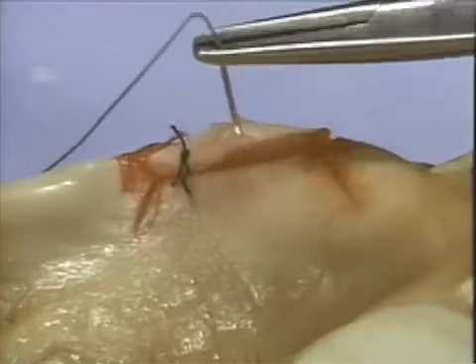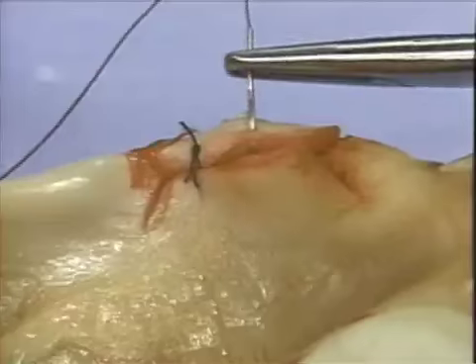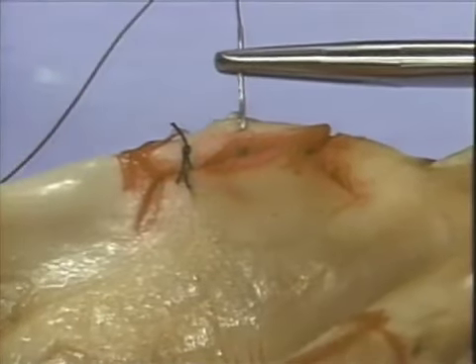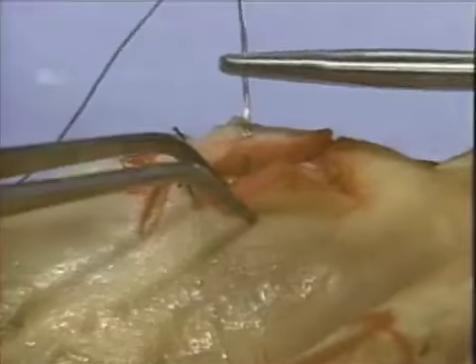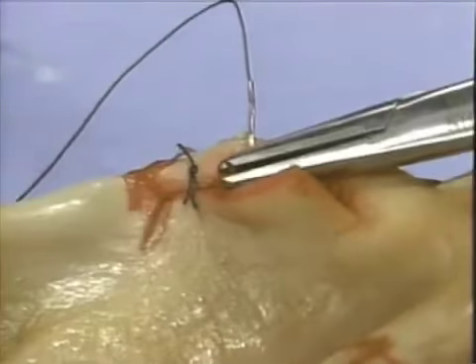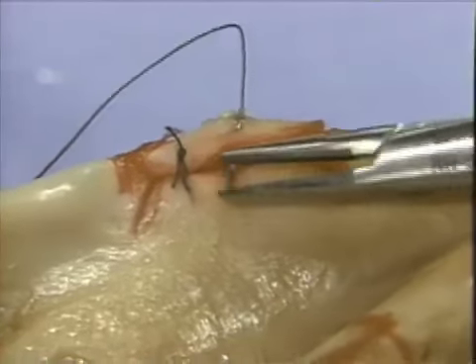We will now compare the figure-8 suture to an interrupted loop suture, which is more widely used in periodontal therapy. In this technique, the suture needle is passed from the oral side of the buccal flap to the tissue side, but then is advanced through the lingual flap from the tissue side to the oral side.